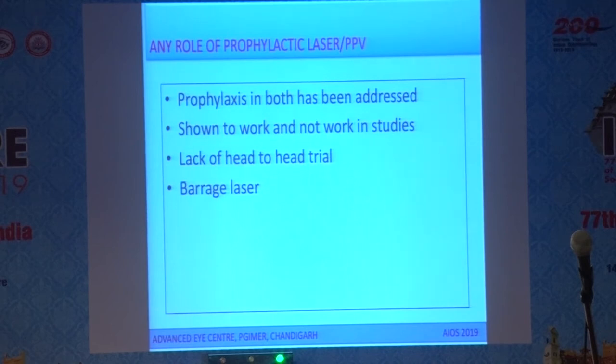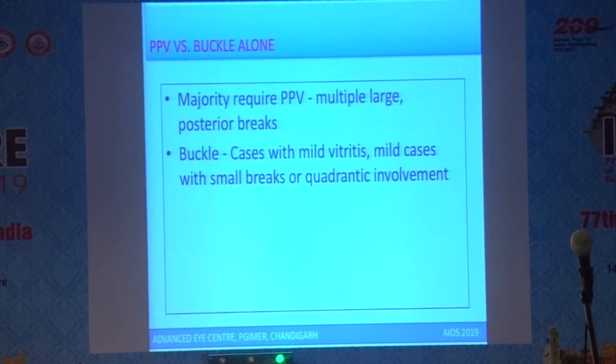So probably by doing a laser there, I'm causing another weak area to which the vitreous is manipulating and trying to produce a break there. So it doesn't work in my hands.